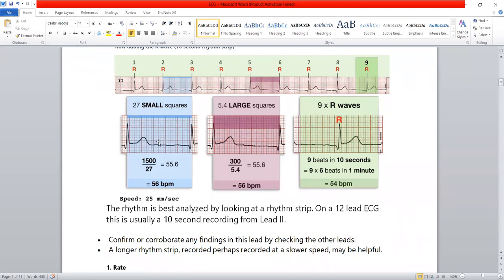When referring to time such as milliseconds or seconds, we count only the 5 small squares along the horizontal axis. So one large square equals 5 mm, it contains 5 small boxes, and therefore one small box is 1 mm.